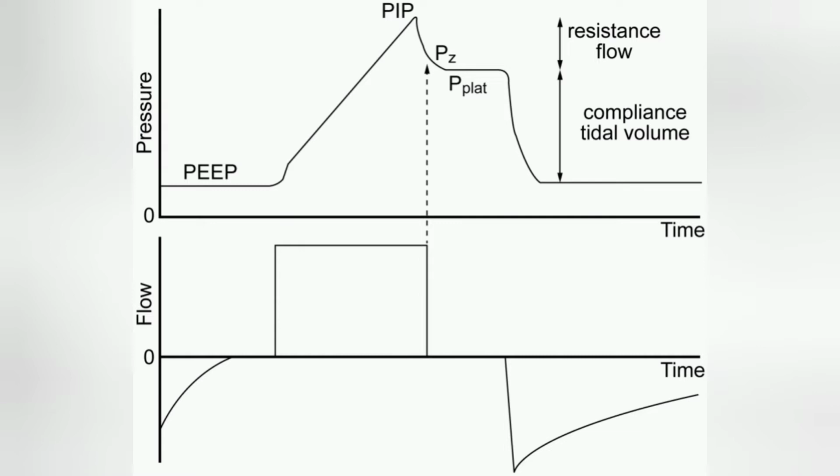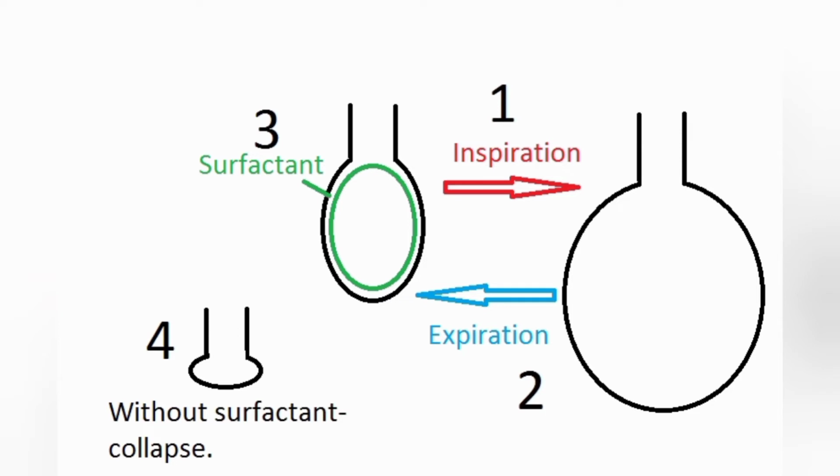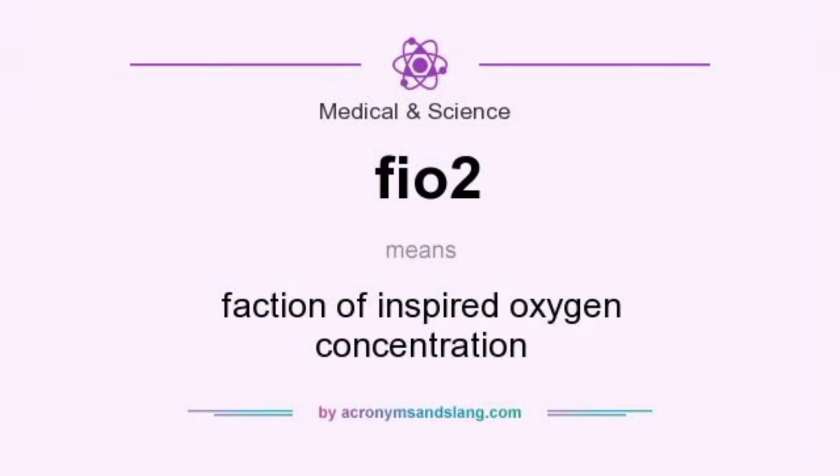When lungs exhale the gas out, then some pressure always remains in lungs. That pressure is called PEEP. PEEP is a natural safety term which prevents lungs from collapsing. Sixth is FiO2. It is the percentage of O2 set in the air mixture going to the patient.